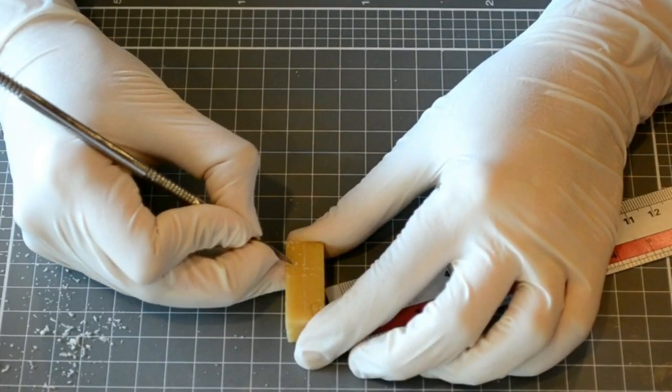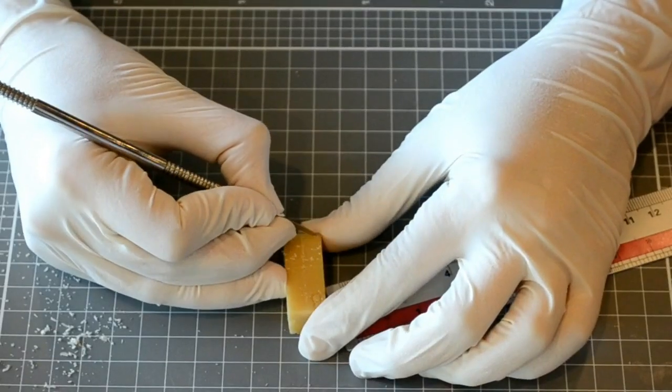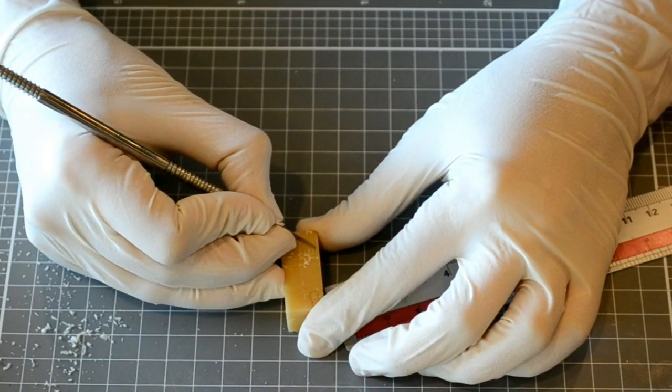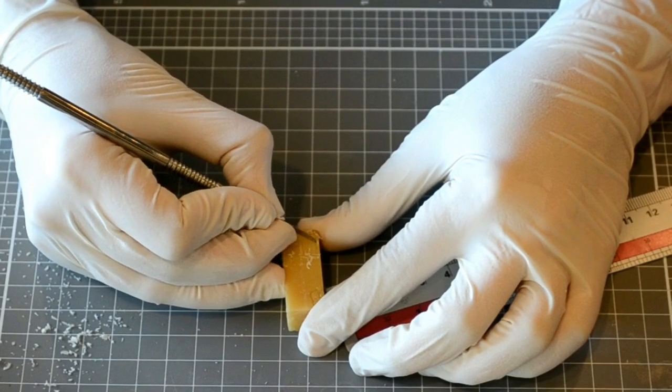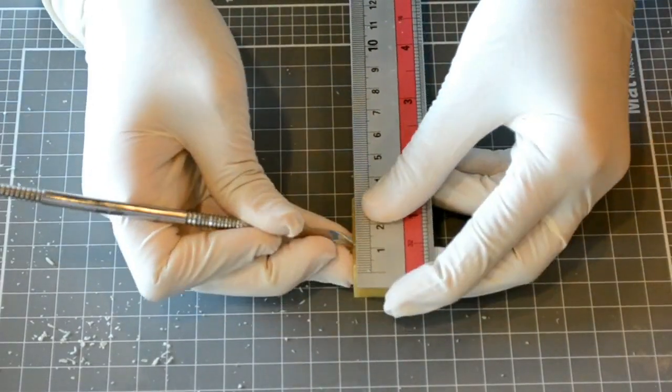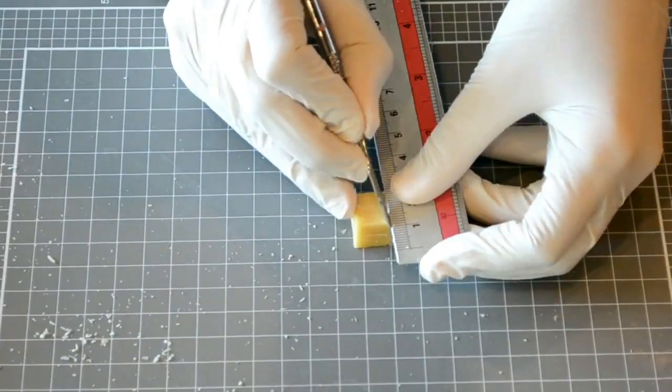Keeping in mind that the mesial outline of the central incisor is straight, while the distal outline is more convex. Remember that the crest of curvature is located mesially on the incisal third and distally on the middle third. Repeat the same steps to carve an outline on the lingual aspect.